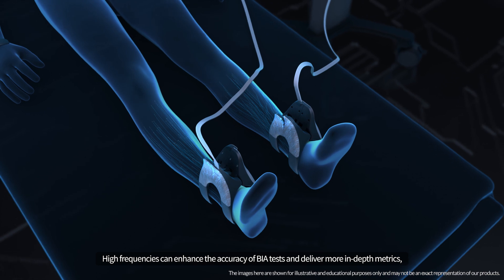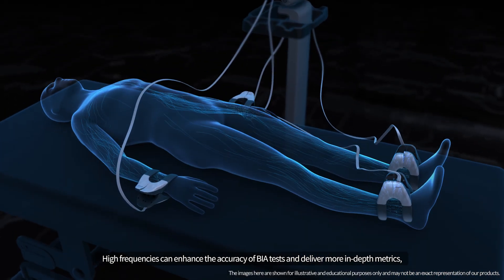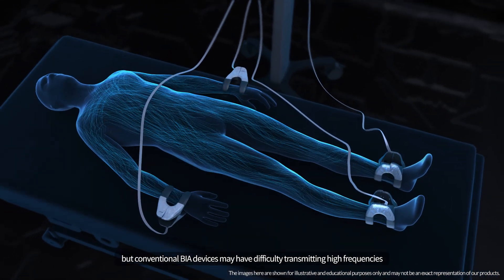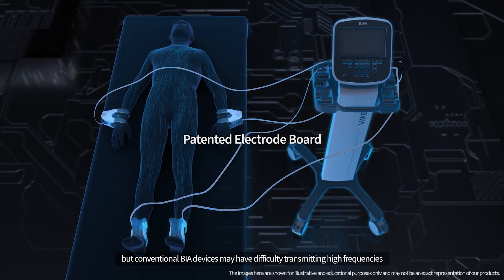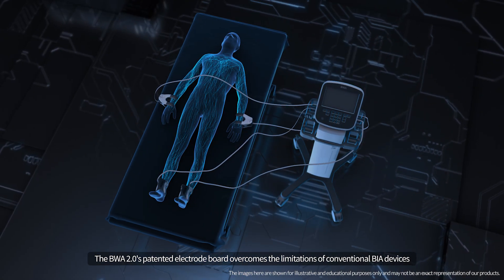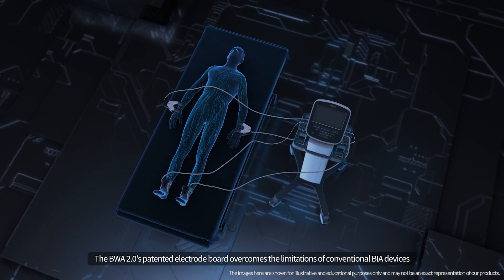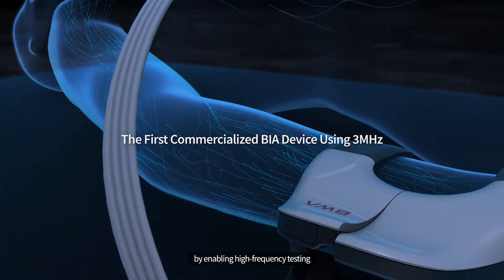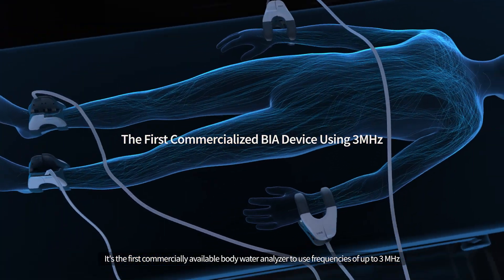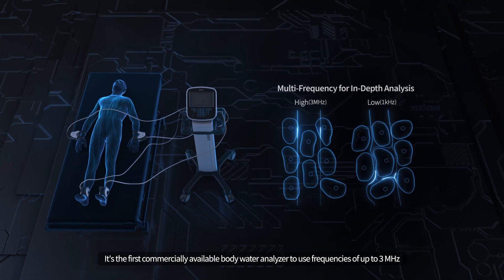High frequencies can enhance the accuracy of BIA tests and deliver more in-depth metrics, but conventional BIA devices may have difficulty transmitting high frequencies. The BWA 2.0's patented electrode board overcomes the limitations of conventional BIA devices by enabling high frequency testing. It's the first commercially available body water analyzer to use frequencies of up to 3 megahertz.